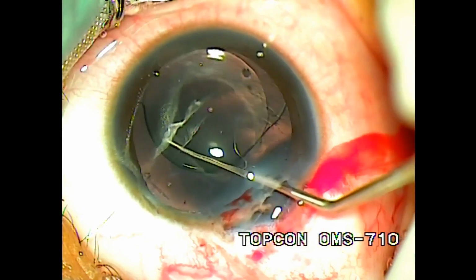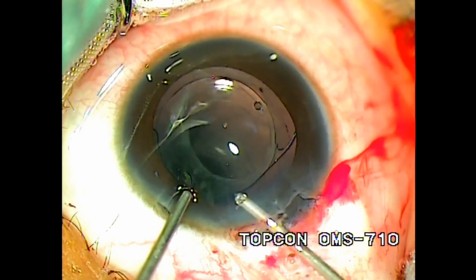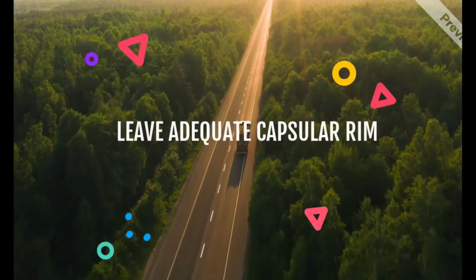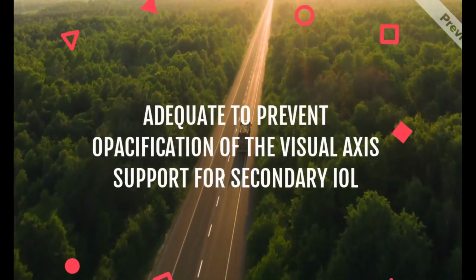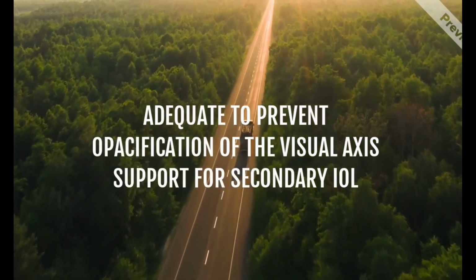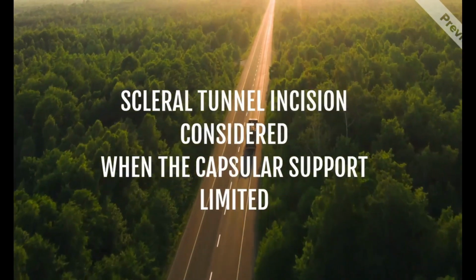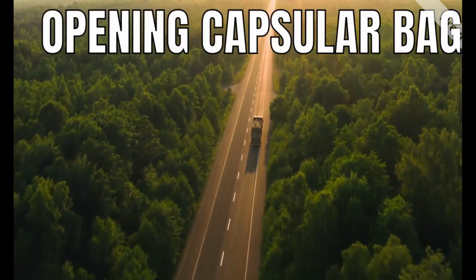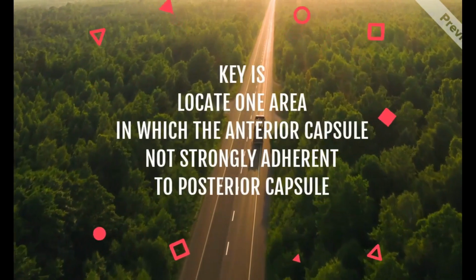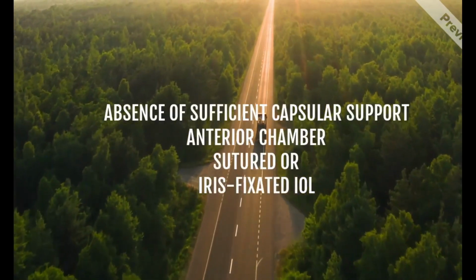While corneal tunnel incisions are usually utilized for secondary IOL implantation, a scleral tunnel incision should be considered when the capsular support is limited. Assess whether it is possible to reopen the capsular bag leaflets. The key is to locate one area in which the anterior capsule edge is not strongly adherent to the posterior capsule. In the absence of available capsular support, sutured IOLs, iris claw lenses, or AC IOLs can be used.